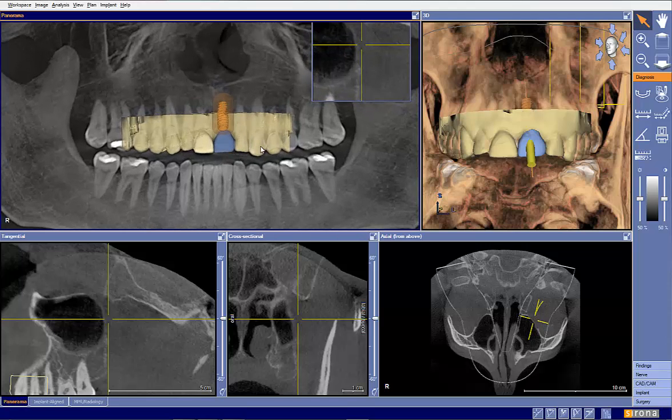Now, if I were to be nitpicky about this, I would love to go back to molars back here, and there's a couple of reasons. One is then I can use a bite block very safely to help hold the guide in. And two, with the OptiGuide, since we don't have that snap fit due to the undercuts, I would like to have a very good stable base. Again, what you have will work, but we're just going based on ideal.